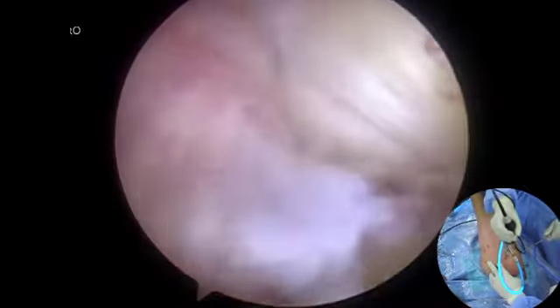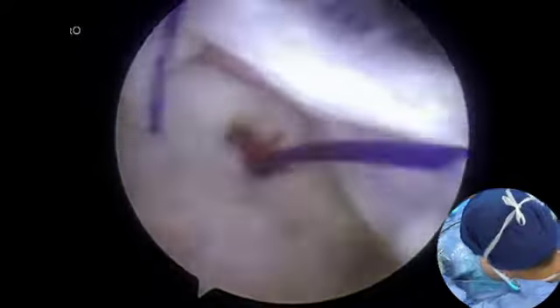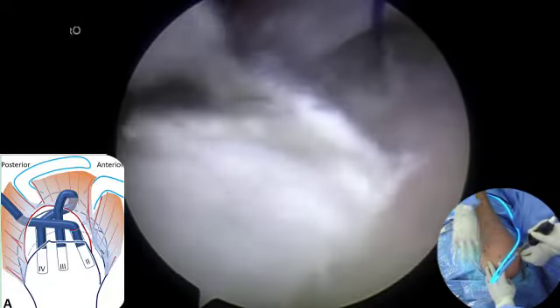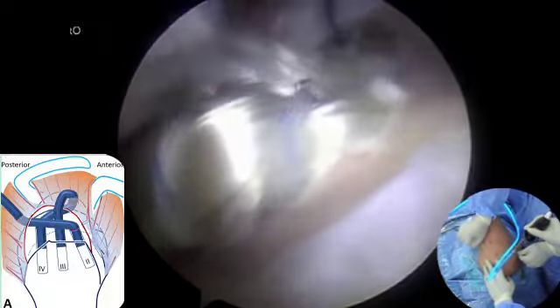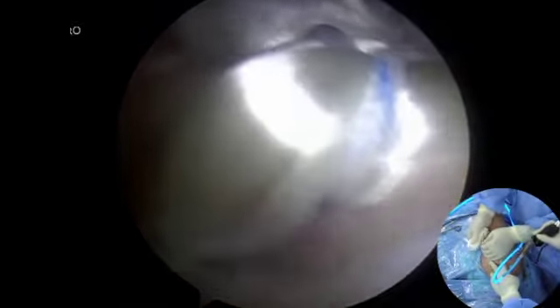A suture retriever is placed in through the infraspinatus. The guide suture in tunnel 2 is retrieved through the infraspinatus out. The supraspinatus graft is passed through the infraspinatus into tunnel 2, and the superior part of the graft is pulled into tunnel 1.